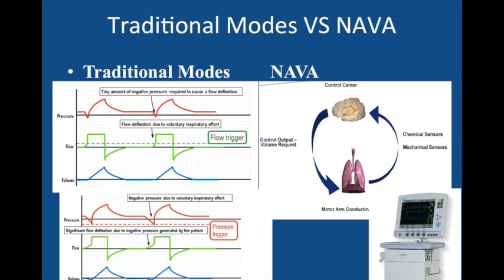By following diaphragm excitations and adjusting the support level in synchrony with the rise and fall of the electrical discharge, the ventilator and the diaphragm work with the same signal input. In fact, this allows the ventilator to function as an extra muscle, unloading extra respiratory work induced by the disease process.